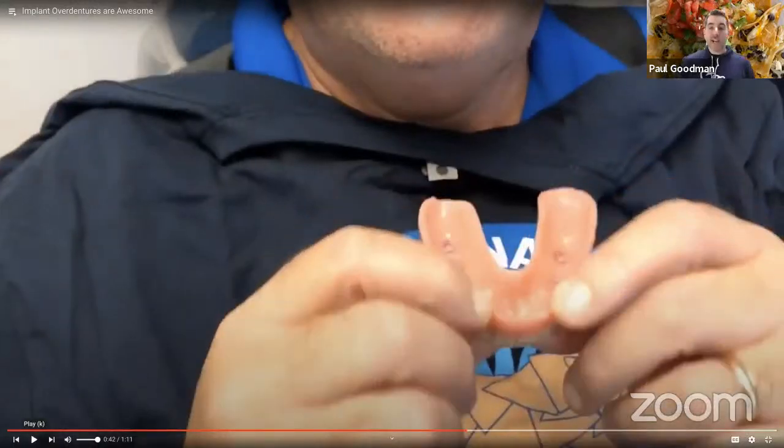Now let's go a little bit deeper into the clinical. Pop them out for us to show us how they work. Good, so they snap into position. So that shows you how the thing works. Your team needs to know that. The patient needs to know that. You can share, there's nothing that covers the roof of your mouth, not the soft palate or hard palate. You'll be able to get the temperature of foods like ice cream.